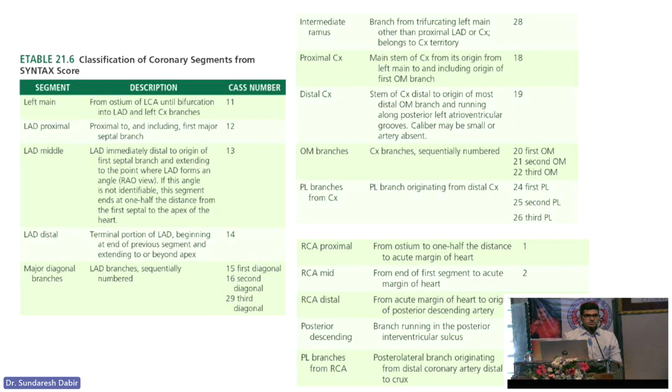Please understand there is no concept of a mid LCX, that is wrong. Anything before the first OM is proximal LCX, and after that is distal LCX. In RCA, the cutoff is the acute marginal. So I'll just show you this.